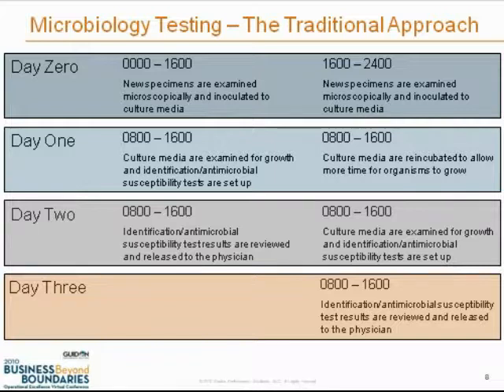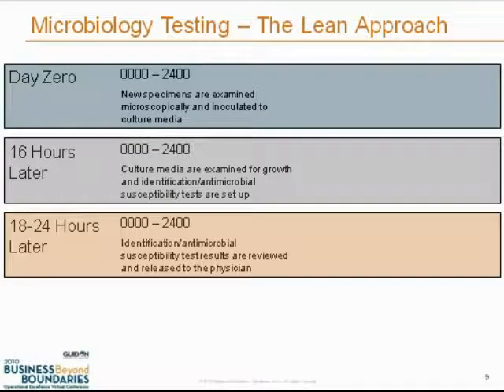Now let's advance to the next slide, which is microbiology testing after a lean evaluation and implementation has taken place. And I think you can see immediately it's a much simpler display. On day 0, once again, the specimens are examined microscopically and inoculated to culture media and then put into the incubator.